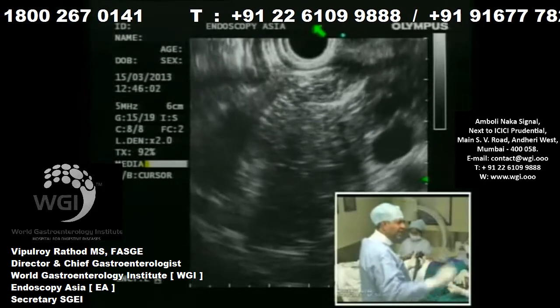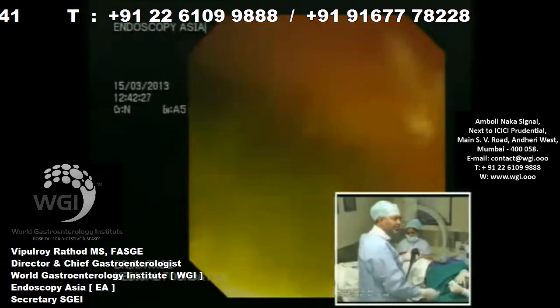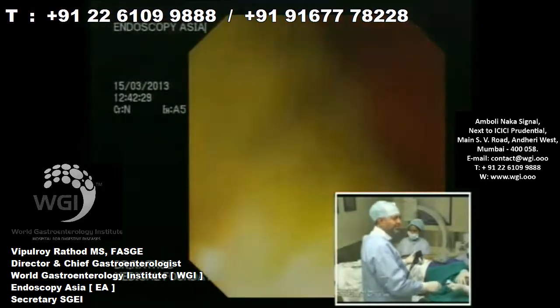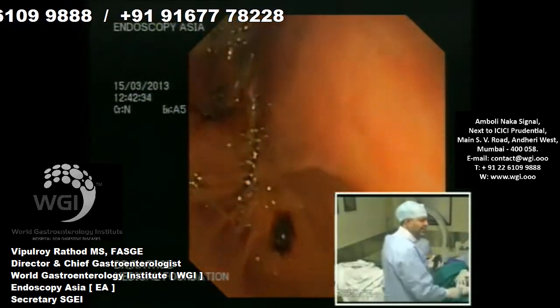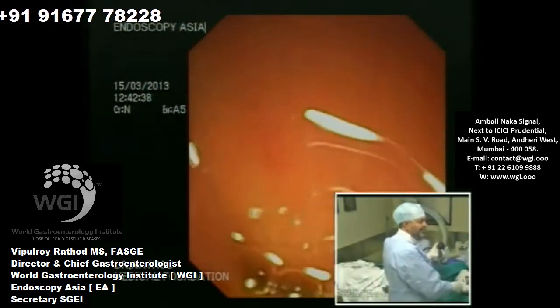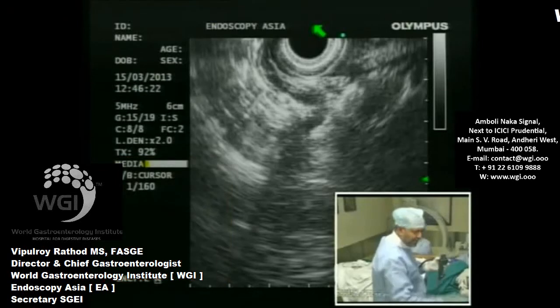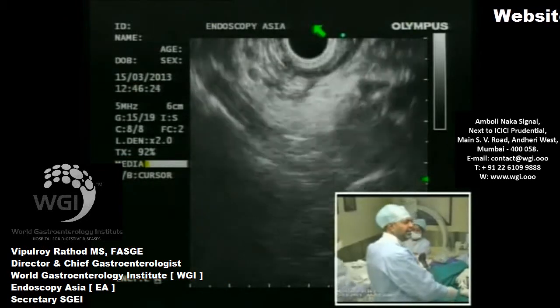I'm still not very happy with the way I want to see the pancreatic head, so I will go again into the duodenum. I'll position myself properly, and then we will evaluate the pancreatic head. So imagine I'm just slipping out into the stomach all the time. So we're going to stay here at the bulb, go to the ultrasound mode, and then start scanning.